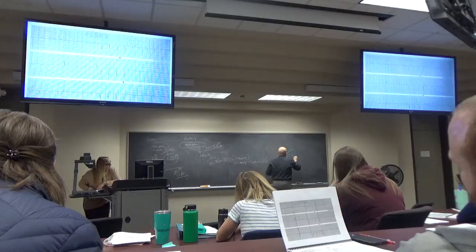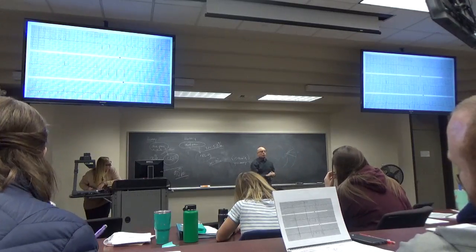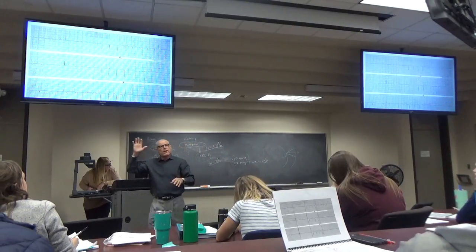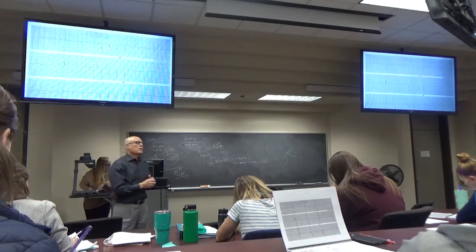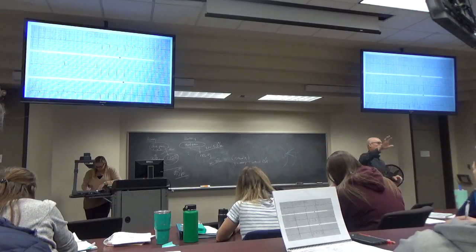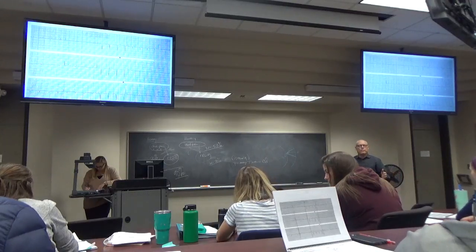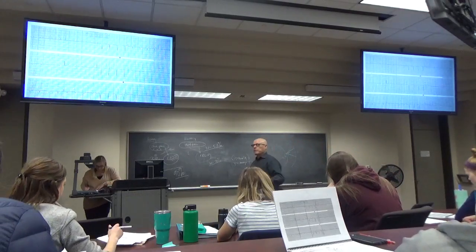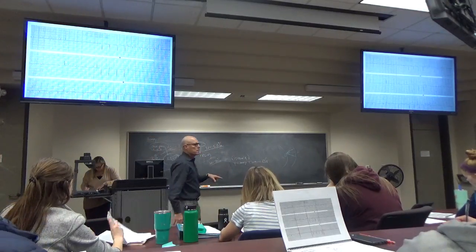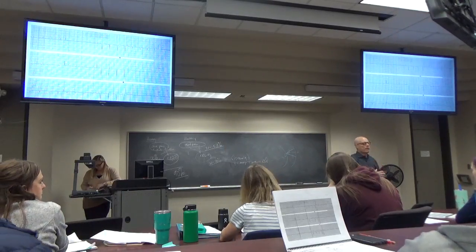Okay? And a Q wave means that you don't see any electricity coming towards you through that wall of the ventricle, so it's all away from you. So you've got a transmural inferior infarction that happened sometime in the past, and you've now got an anterolateral infarction, and the patient's laying there talking. Well, we don't know that for a fact, because we're not there, but we do know that they were alive when they got this EKG. What if the infarct was occurring simultaneously in the inferior wall and the anterolateral wall?